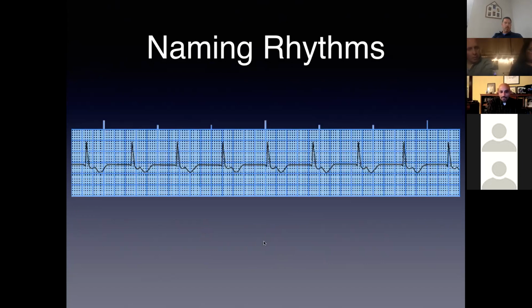What do we call this? Ugly. Sorry about the blue color there, a little hard to see. Yeah, it is. It's still a junctional rhythm, isn't it? It's still a junctional rhythm, but how is it different from the one before? Inverted T wave. Two differences. Somebody said one of them, and I think you said there's a retrograde P wave. See this thing here? That's a P wave that's being sent up from the AV node rather than coming down from the SA node. If the rhythm is starting in the AV node, it's junctional. Then it travels up, and you get a P wave that comes in the middle of the T wave here because it's going retrograde. So that's one difference.